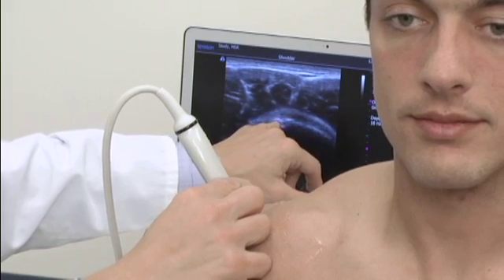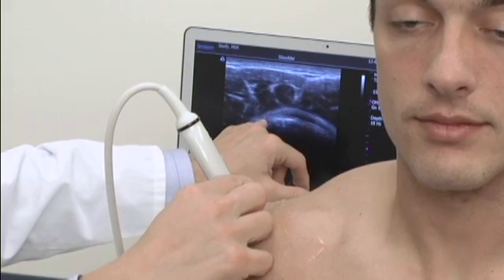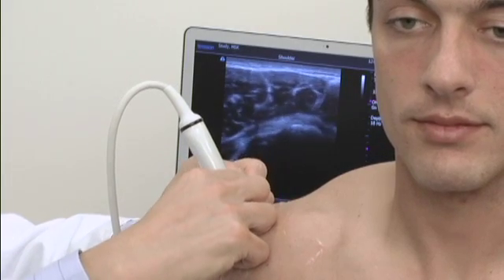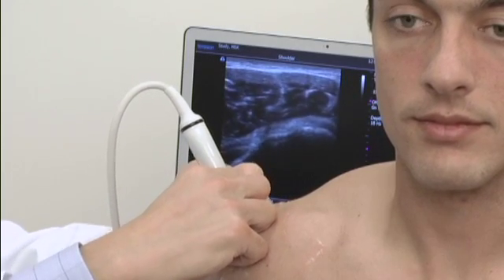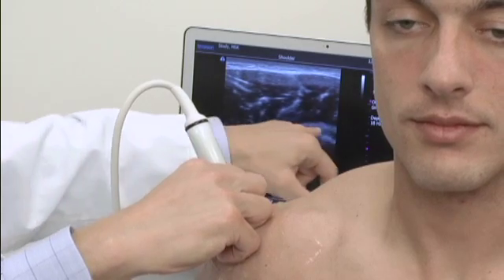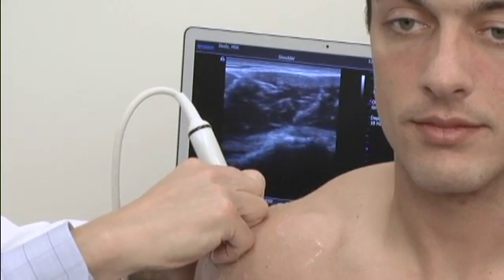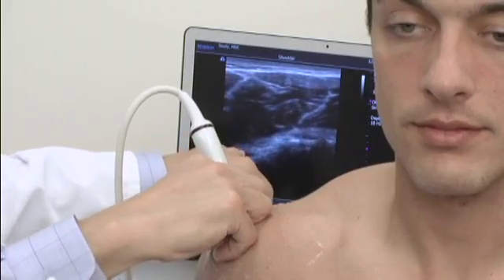Anteriorly in this region is the supraspinatus. A little bit further, this becomes the infraspinatus. And if I were to continue to move the probe posteriorly — the screen left being posterior, the screen right being anterior — we will come to the teres minor, which is right in this region.